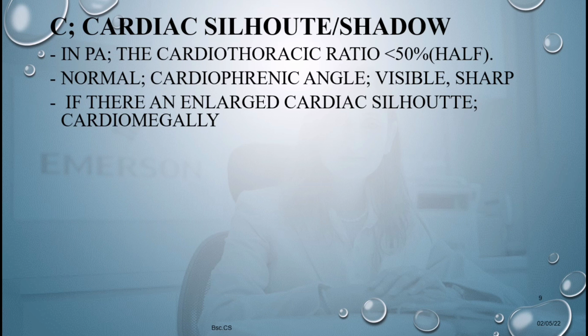Follow the edges where they are, then put your fingers across them, then put them on where the spine shows. So if you see that one of your fingers is moving out of the chest, then that means it's cardiomegaly. Yeah, but this is easier if I'm actually showing the exact x-ray.